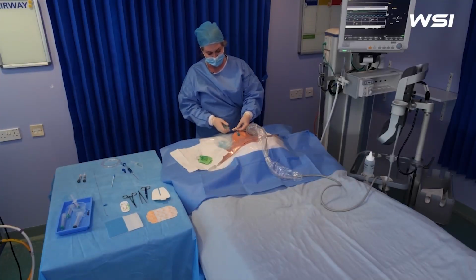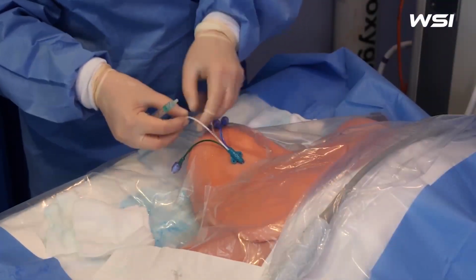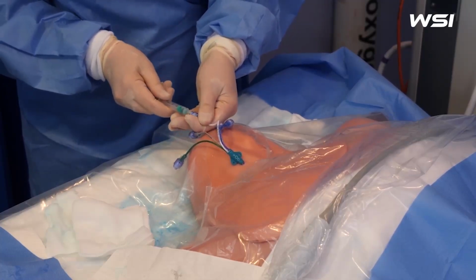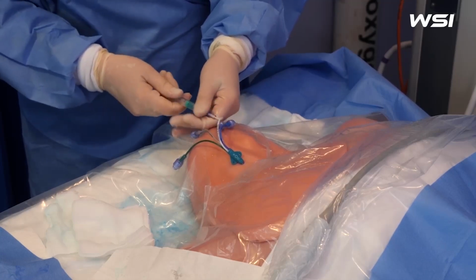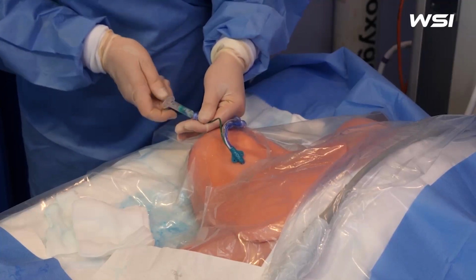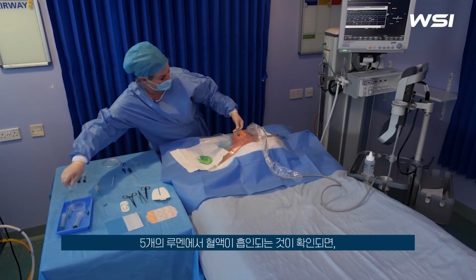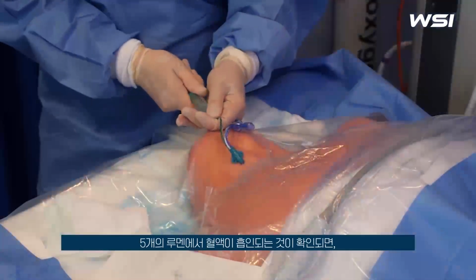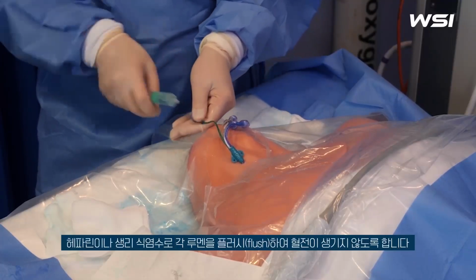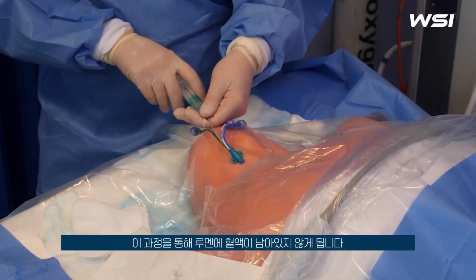This is a completely sterile field, so arguably you can just withdraw and flush. The other thing you can do is withdraw all of the lumens. Make sure you've got blood coming into each lumen, like so. And then, once you know all 5 lumens are aspirating, just then go through and flush each of them with, for example, 2 ml of saline. You've then effectively locked them, and there's no blood left in the lumens.